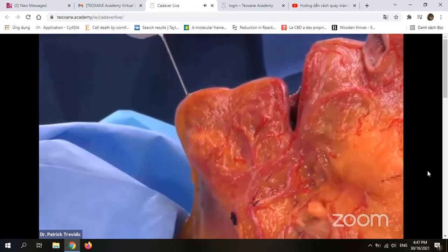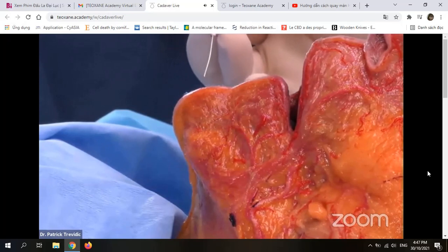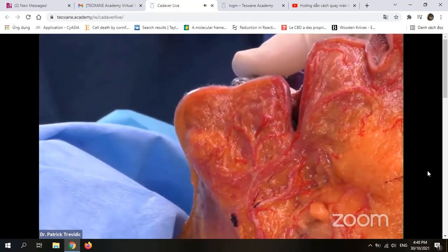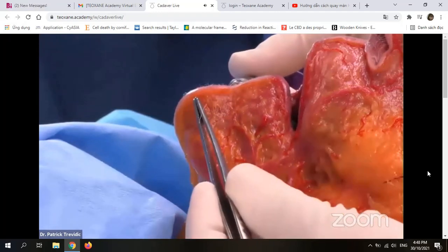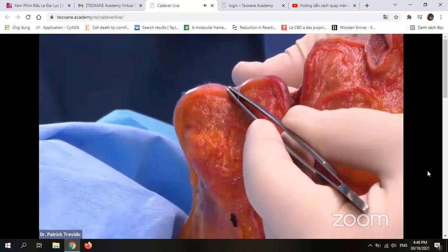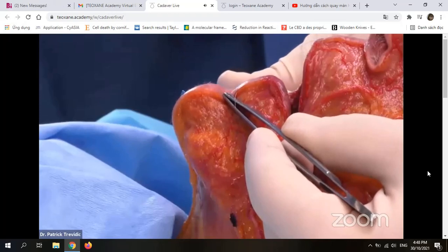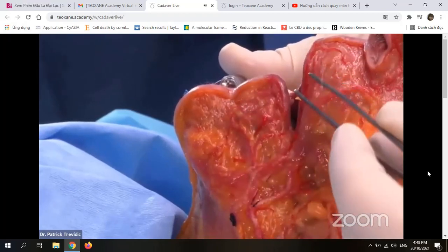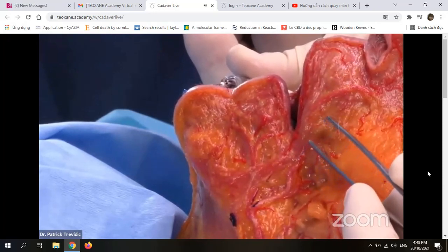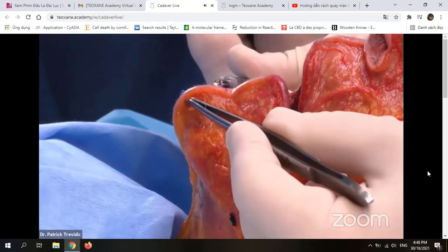And what she did also is injection in a superficial way. If you are looking at this superficial area, this is the fat, as you can see. So if I push my cannula superficially in the chin, and you go just here, push, Sasha, you will see that my injection of blue HA will be, as you can see here, very superficial.